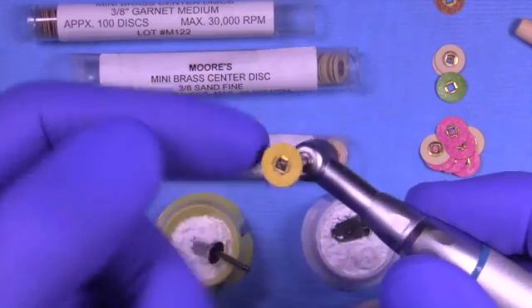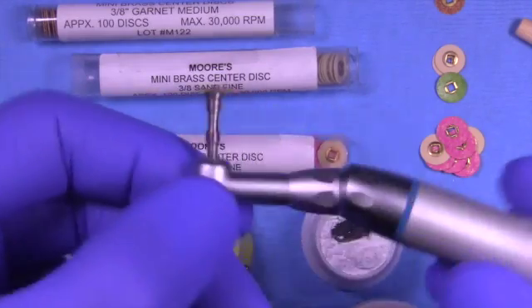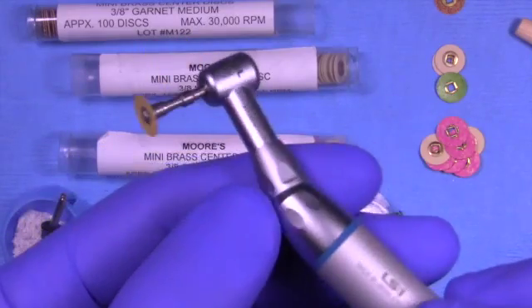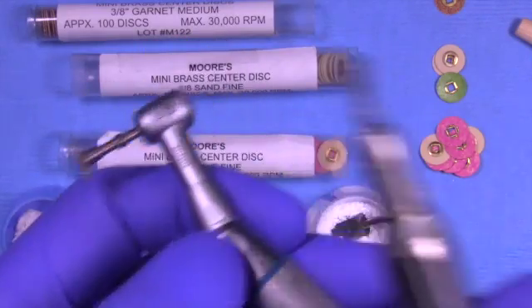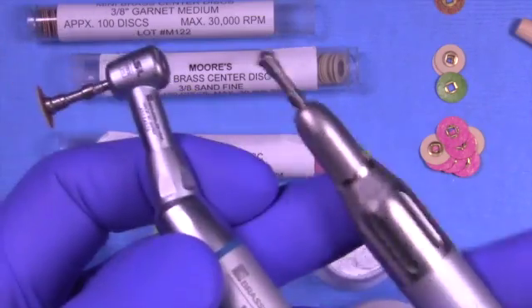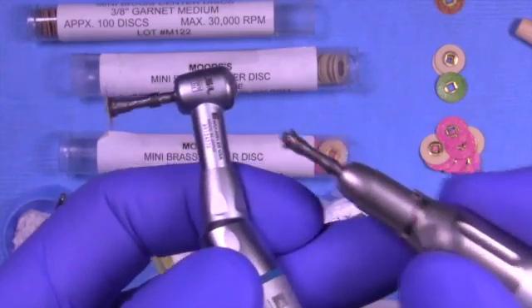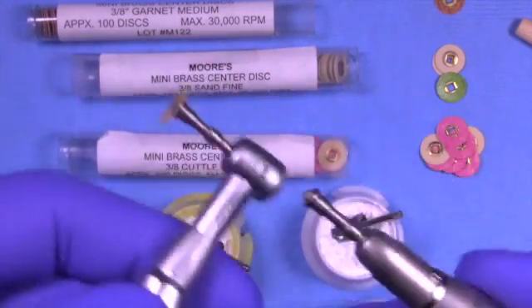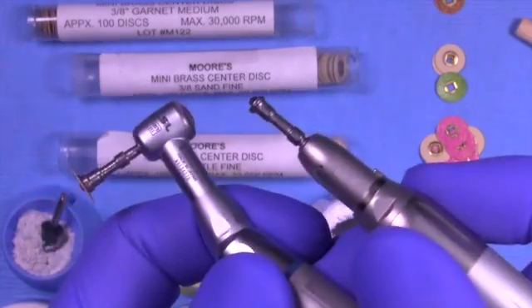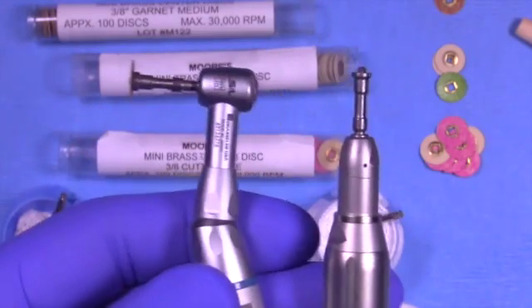One of the important things about finishing castings is to always rotate the disc from gold to tooth structure, which means you're going to be constantly changing the direction of forward and reverse of both the latch type and the straight handpiece.